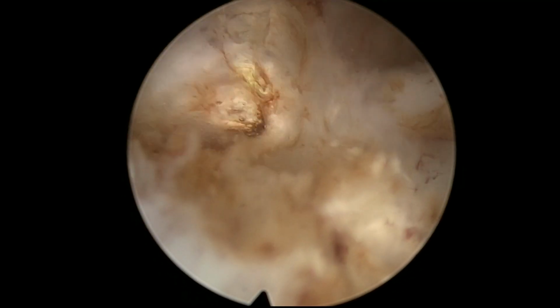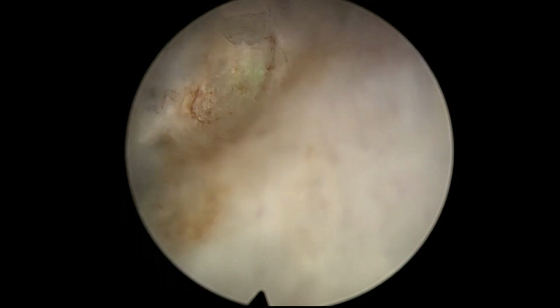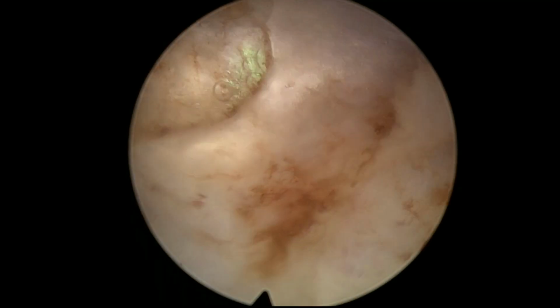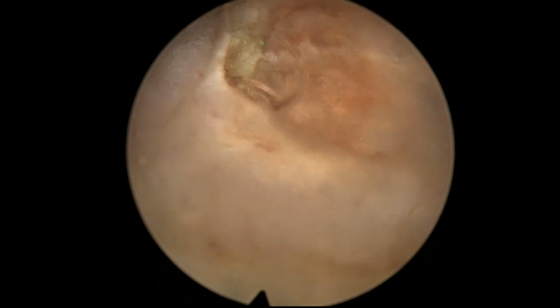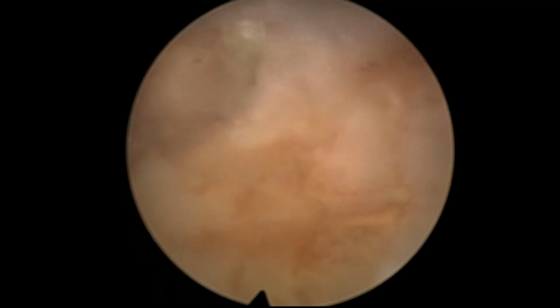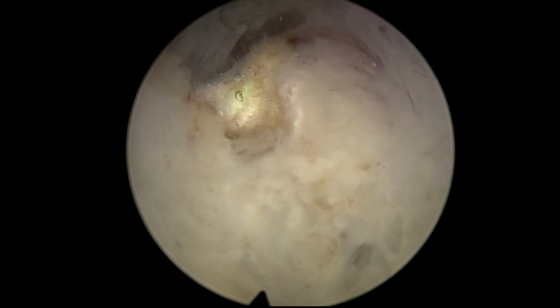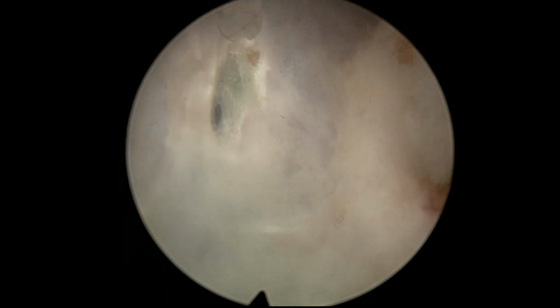Also, the adenoma is dropping, the tip of the adenoma is dropping from the ceiling. So these 12 o'clock fibers verticalize a little bit and we can cut them very nicely. And from this moment forward, I think the technique is quite easy because you have to just go around the adenoma and trying to understand the anatomy. So that was a nodule that I could see, so I could go around it.